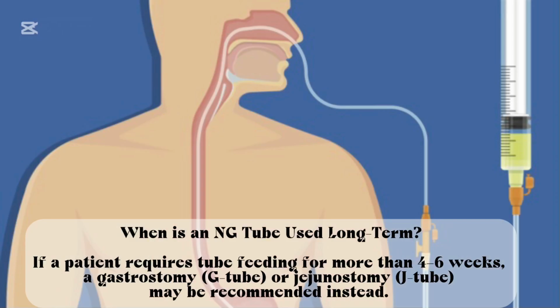When is an NG tube used long-term? If a patient requires tube feeding for more than 4 to 6 weeks, a gastrostomy G tube or jejunostomy J tube may be recommended instead.